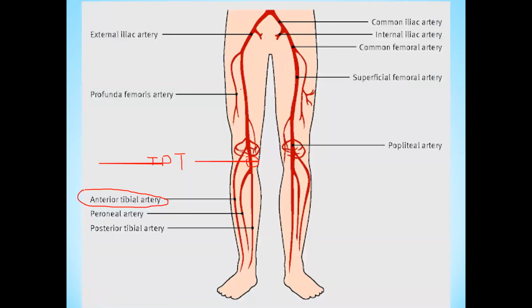First of all, it's mandatory to expose the entire leg of the patient, because in cases of any hesitation, the clothing of the patient can hinder the examination. That's why the privacy of the patient is mandatory, but the exposure of the region of interest is of utmost importance for accurate examination techniques.